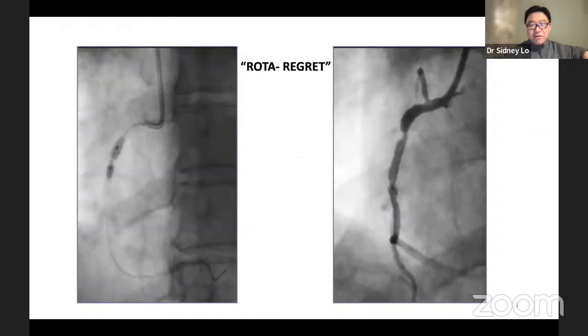So Jack already told you, we used to regret this after we put a stent in and say, maybe we should have rotationally atherectomized this before we put a stent in. So now we are very conscious of calcium if we see a lot of angiographic calcium. So core lab definitions of calcium on either wall will increase your probability of modifying this plaque.